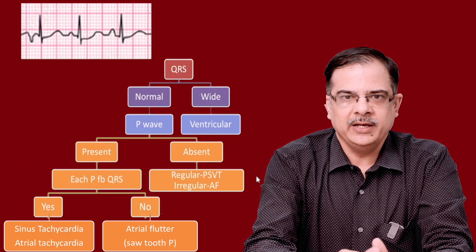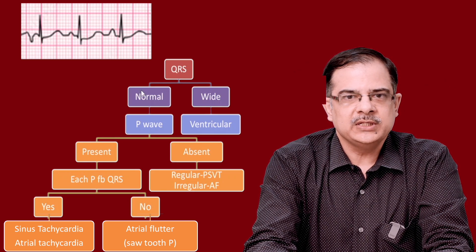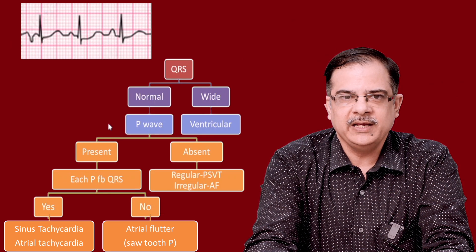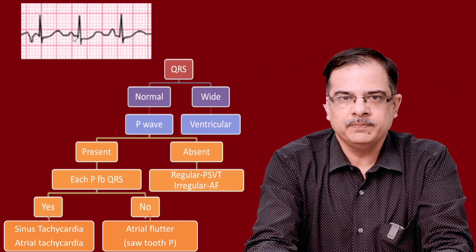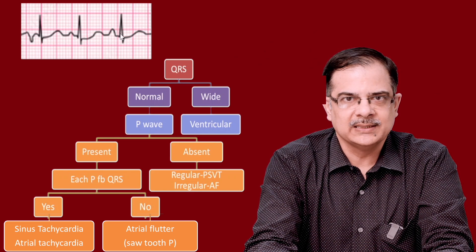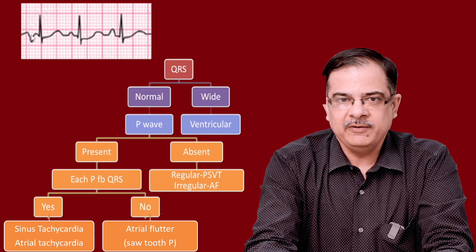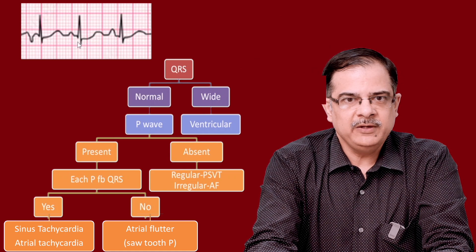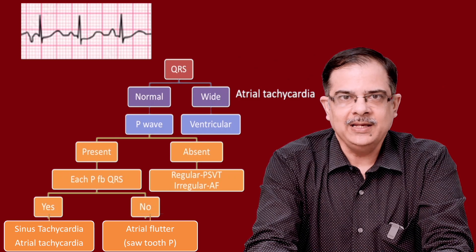Applying the same flowchart to the next ECG: QRS complex is normal. P wave is present before the QRS — clearly visible. Each P is followed by QRS — yes. However, assessing the P wave morphology: one P wave is negative, then a positive P wave, then a slightly tall P wave. These P waves are changing their morphologies throughout the ECG. Therefore this is most likely atrial tachycardia.